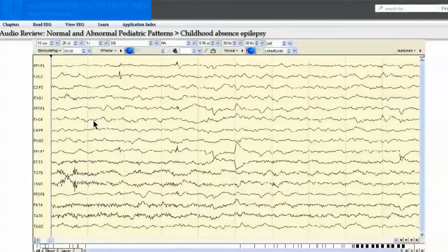This EEG was obtained in a child. There are a number of features, nonetheless, outside the brainwave activity which may confuse the interpreter. For example, here we have a sudden upgoing wave with a mirror image on the other side. This is a positive phase reversal. Somewhat before it was the reverse, a negative phase reversal, and we see one towards the end. This phenomenon here represents electrode movement artifact, or even pop artifact of the F7 electrode.